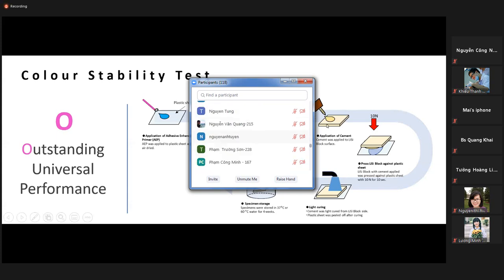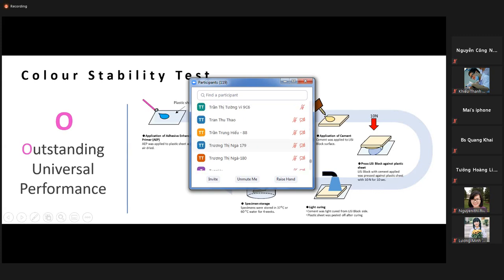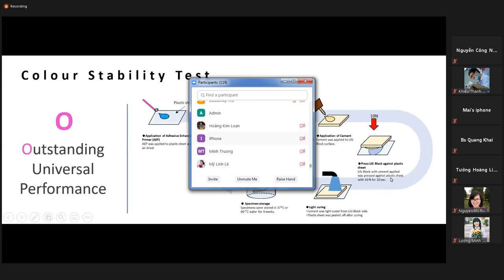And then this block is taken and pressed against this plastic sheet. So there are specifics here, with a 10 Newton force for 10 seconds.